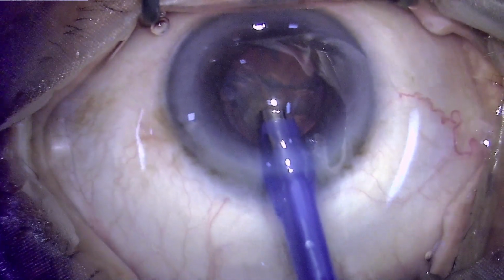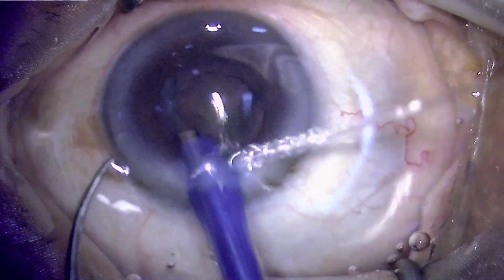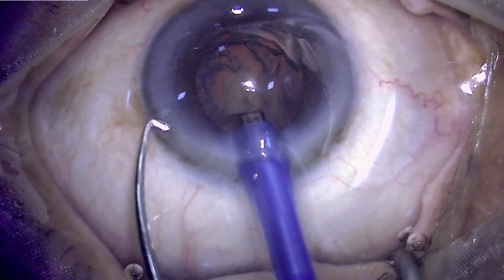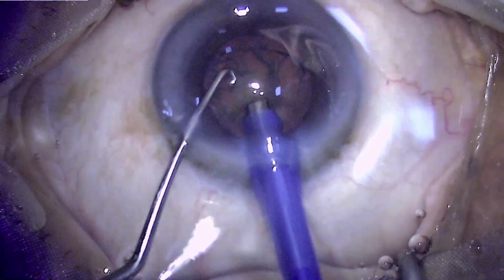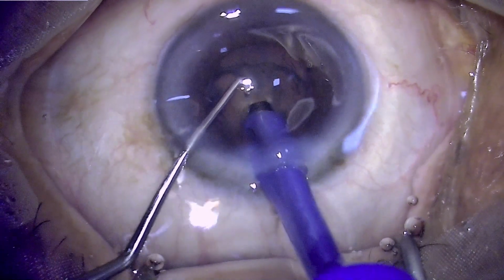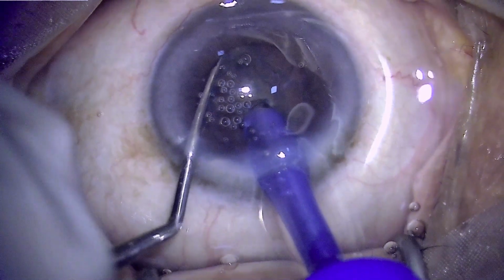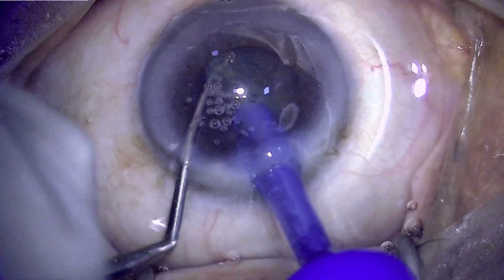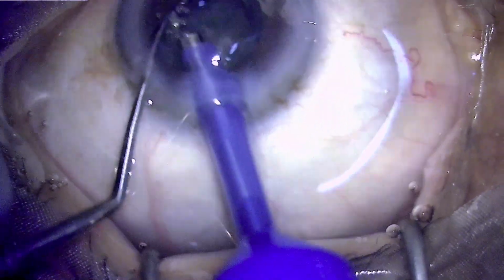and as usual using the direct horizontal chop technique, and this is a Nagahara blunt chopper which has a blunt tip and an inner edge which is sharp, although it doesn't matter because basically we have to lacerate the nucleus. So going underneath the rhexis border and then crushing this tissue and then separating it, so making a figure of L.